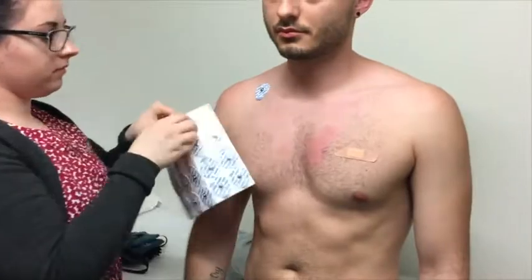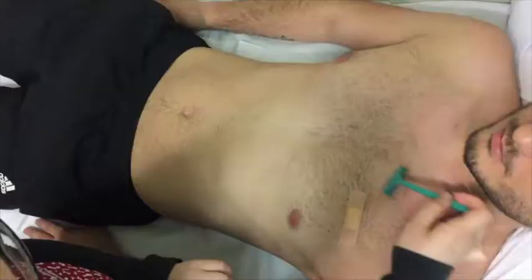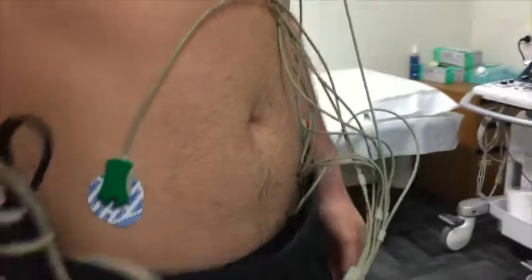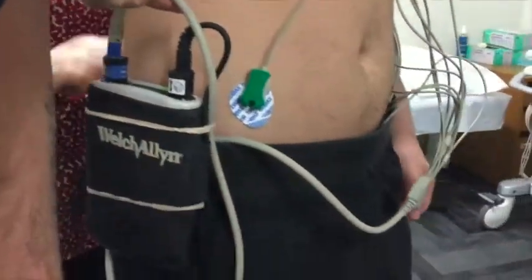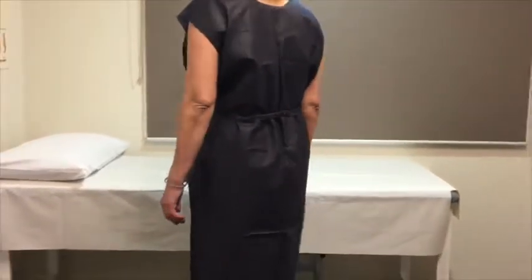The technologist will place the ECG electrodes on your chest. Thick chest hair may need to be shaved off. For female patients, the bra can be worn after placing the ECG electrodes. Women can wear a disposable single-use gown.